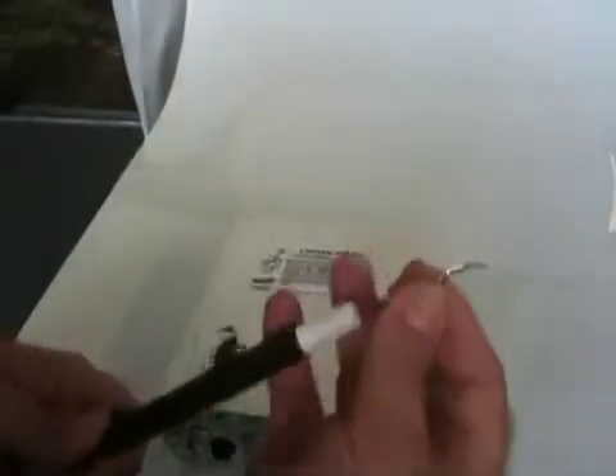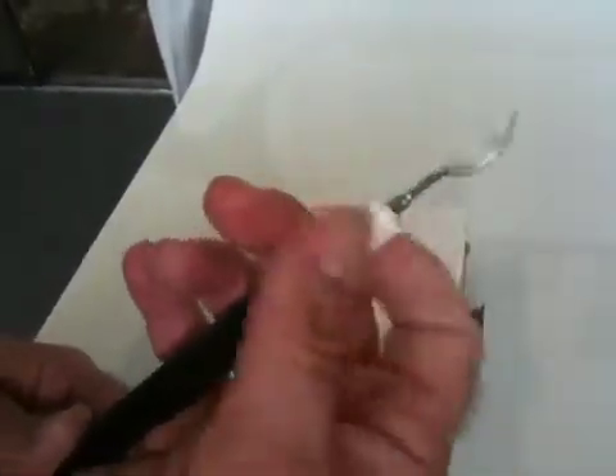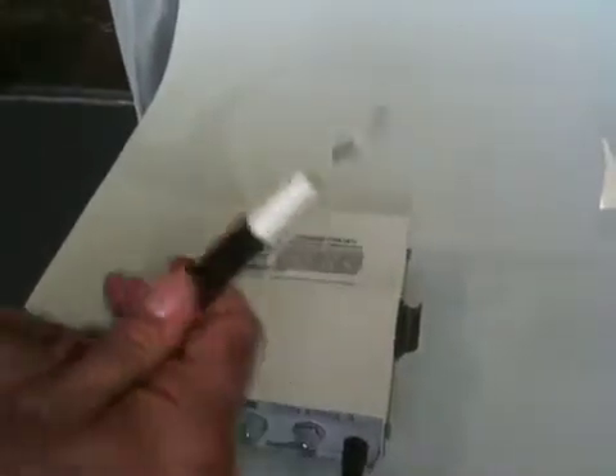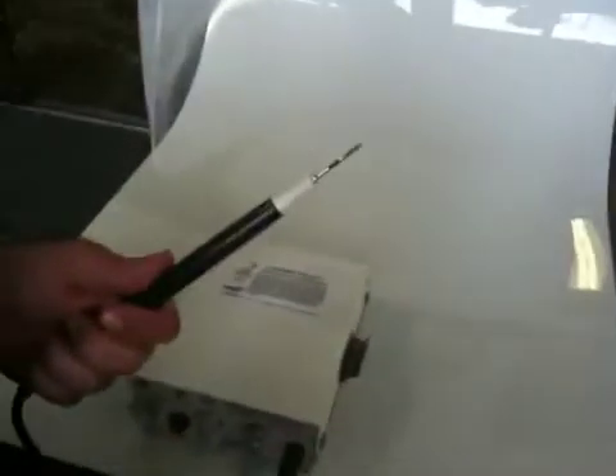Then you want to take the tip and guide it in through the nose cone where it's designed, and hand screw it in until it tightens up. Then give it one last little tug tighter to make sure it's proper. You do not want to use the tip wrench to tighten the tip — only to unscrew the tip. Otherwise, you will damage it.